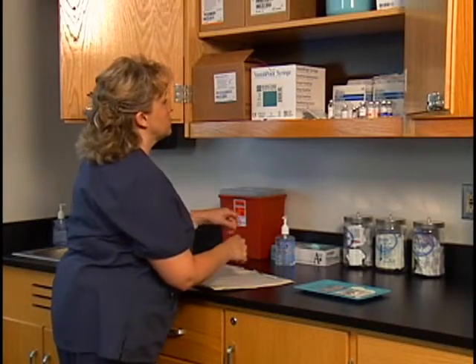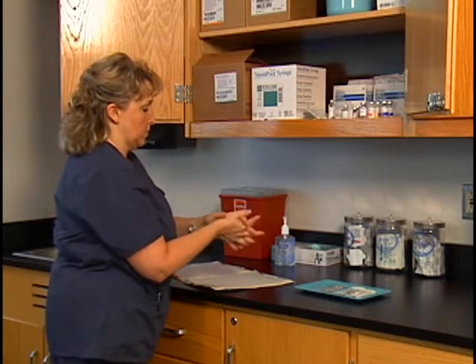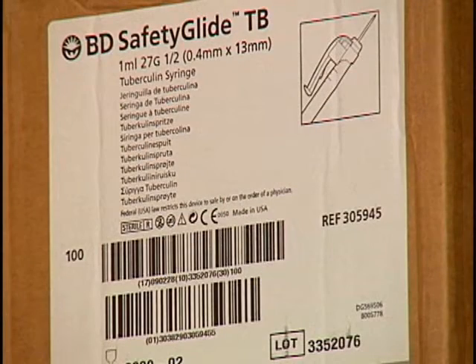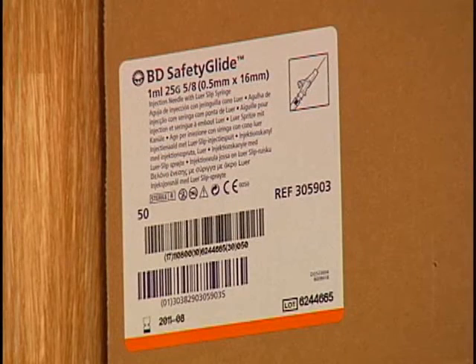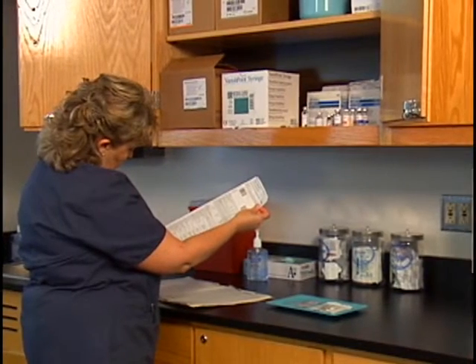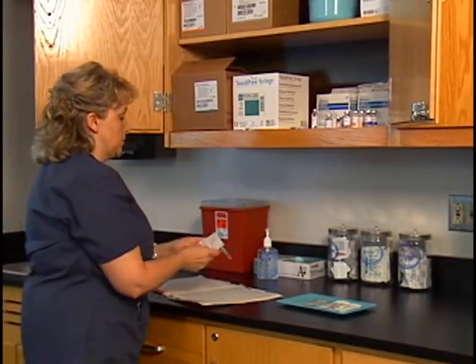To prepare an injection for administration from a vial, begin by sanitizing your hands. Assemble the equipment. You will need the appropriate syringe and needle for the type of injection to be administered and an antiseptic wipe. Work in a quiet and well-lit atmosphere. Good lighting helps you read the medication label.